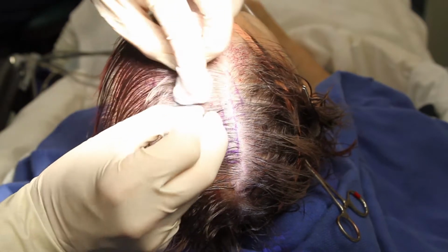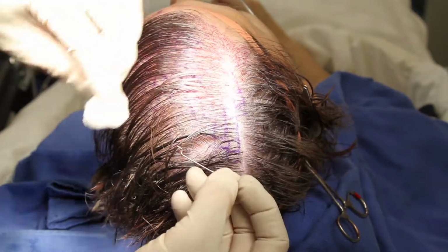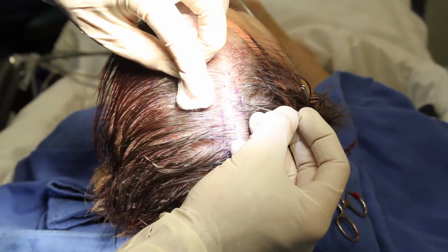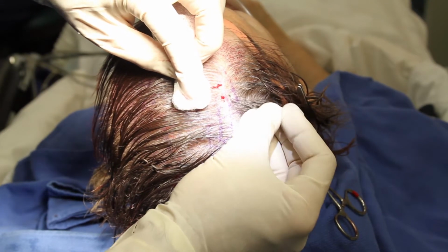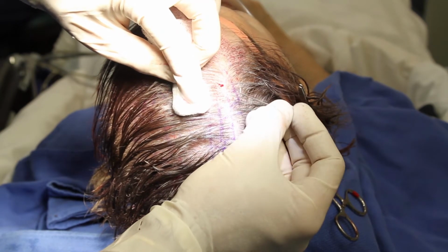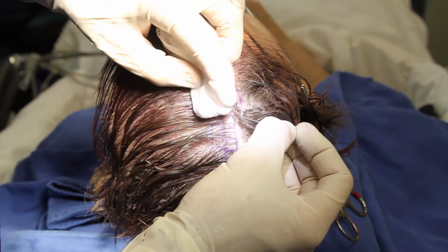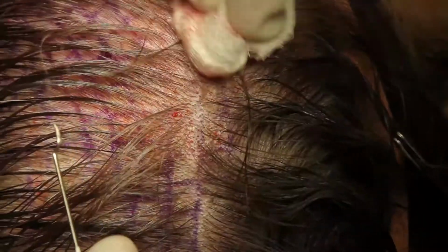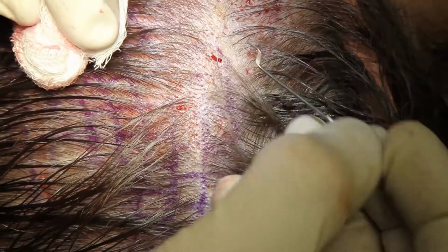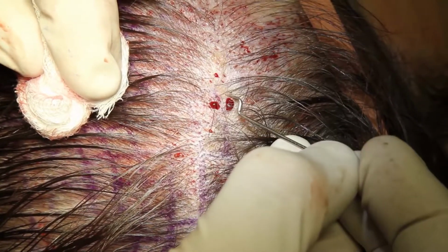And you can see I'm angling this so it helps to accentuate his natural part. So that's really the strategy in hair grafting, and for every person it's different. It depends on their style, it depends on how many grafts they want to place, what their investment is, and then we're doing this as simple math. I'm just sitting here counting each one of these as I place them very carefully between each hair. Now I'm working right along his part side, and you can see that the hair goes in different directions, so I'm altering the direction in which I'm making the little slit to accommodate that.